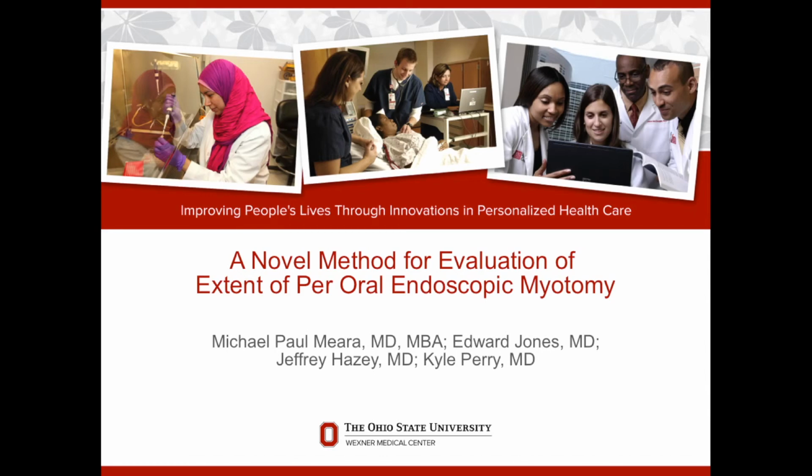This method can be completed rapidly and provides excellent visualization of the distal extent of the POEM tunnel dissection. This maneuver can be performed with little to no added cost and with instrumentation already owned, mitigating the need to purchase additional equipment.